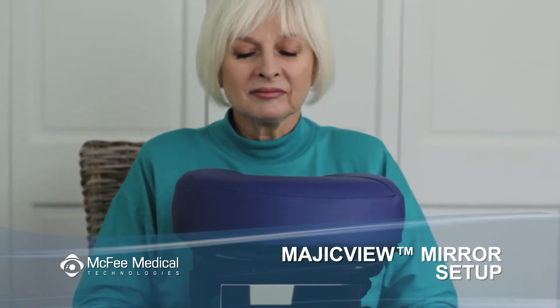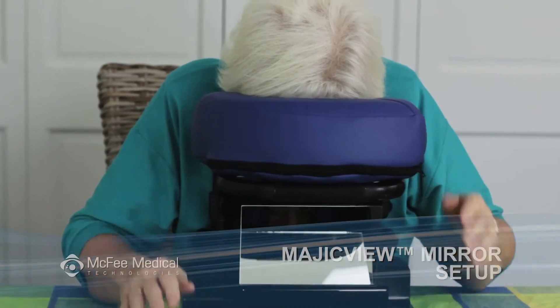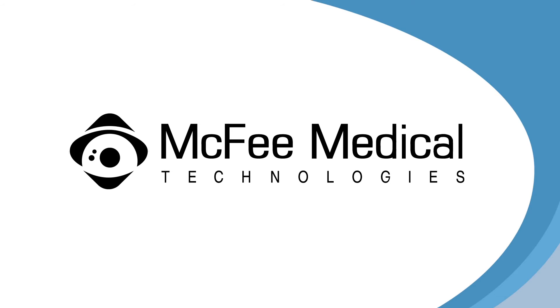Look down at the lower mirror. Your line of sight will be reflected upward into the other mirror and then outward in a near horizontal direction. The dual mirror system produces an image that is upright, as in normal sight. The closer the Magic View Mirror is to your face, the broader the viewing area will be.